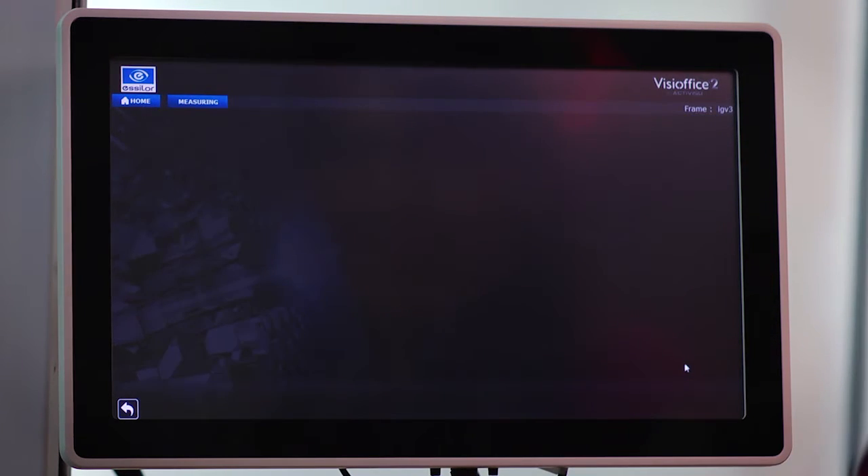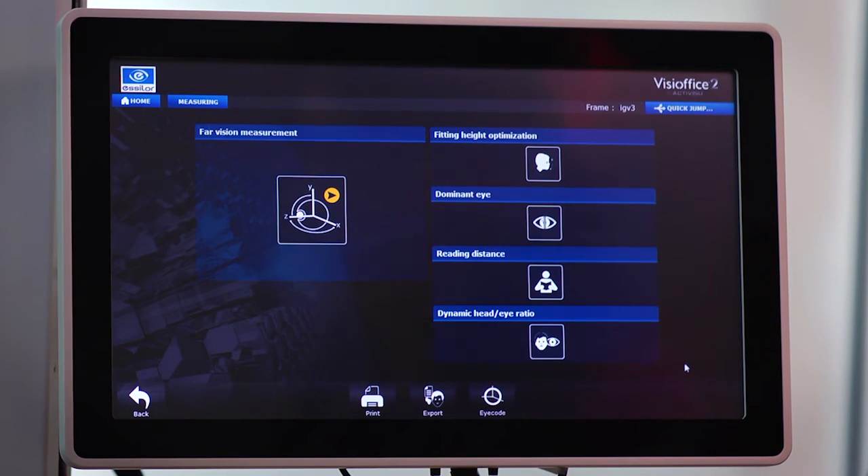If you're dispensing a lens design that requires additional personalized measurements, continue with those. Then return to boxing when you're done. It's going to be exact for your eye.